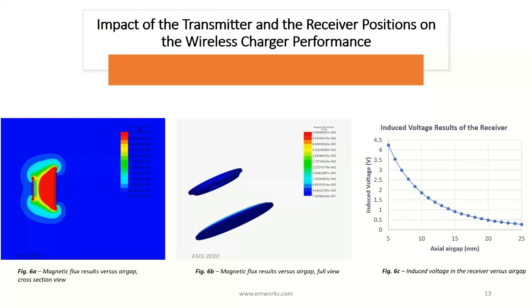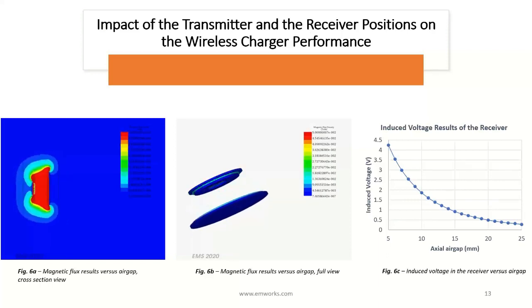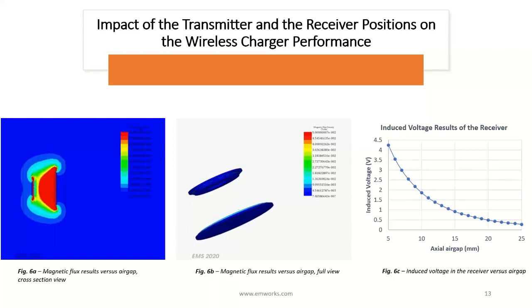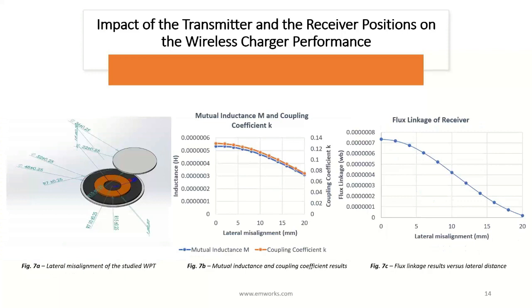So as a conclusion, we should keep the air gap as small as possible, but this depends on several factors, like the depth of the implanted receiver inside the human body. In addition to the axial air gap, when we have two contactless parts, it is expected to not have a full or perfect alignment between them. So lateral or, at the same time, angular misalignments can occur between the transmitter and the receiver coils.